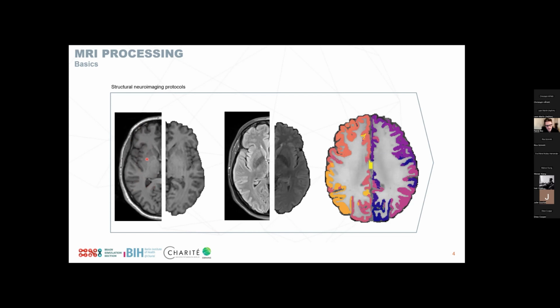Generally, we then have a high resolution T2 image, but in our case, most of the data that we see throughout this presentation will be just our stroke use case. We actually have FLAIR images, which have the advantage that they are very susceptible to liquids in the brain, right? FLAIR stands for fluid attenuated inversion recovery. So it's generally used in the clinic if we talk about stroke patients to really get a good estimate and a good view of an actual lesion, right?